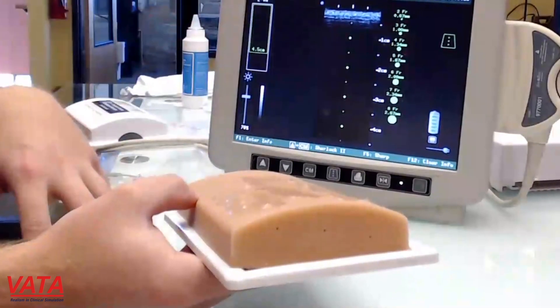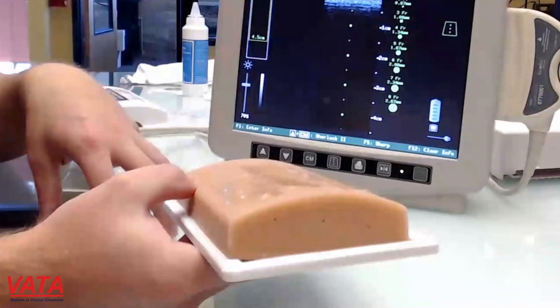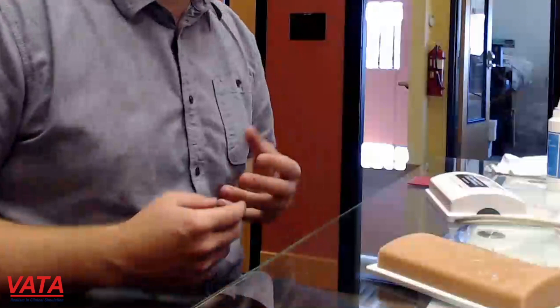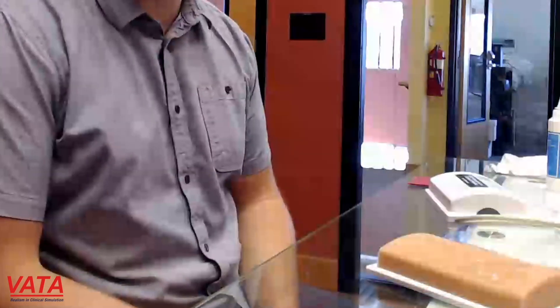You're going to be able to get thousands of sticks on this using a 20 or 22 gauge needle. Please don't use anything bigger than that if you want it to last longer. If you are doing something where you need to use a larger needle or you're wanting to practice starting a PICC line with an introducer, it will work — it's just going to kill the model quicker and you're going to have a shorter lifetime model.